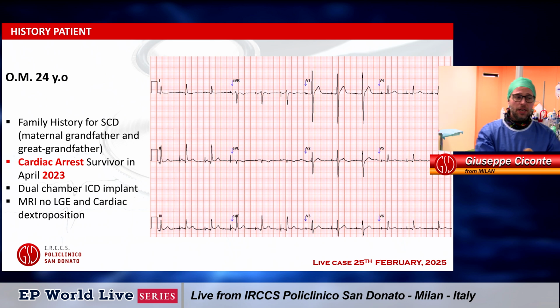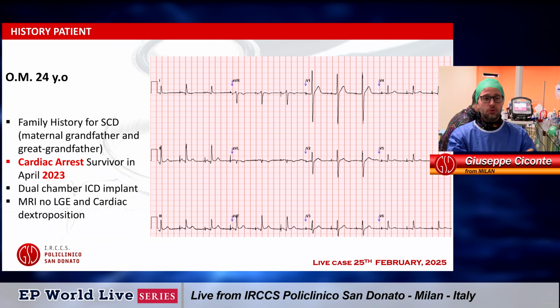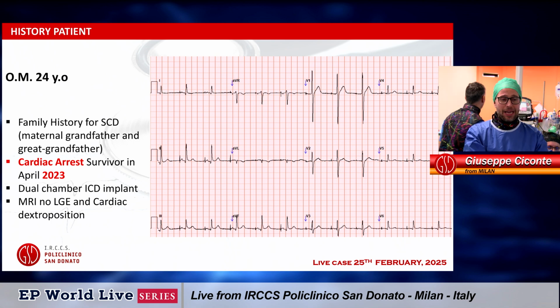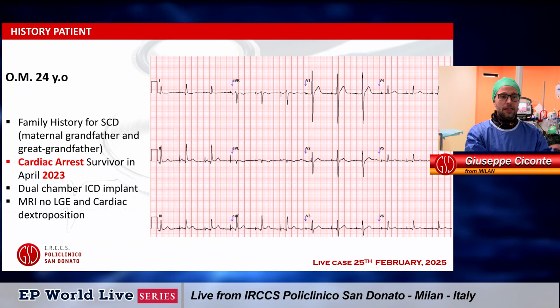Of interest here, we can see the ECG. Although you might see, due to his bradycardia, the pacing in the right atrium, you can clearly appreciate in the inferior leads an early repolarization pattern. Here you see a pseudo delta wave in the terminal part of the QRS, indicating a late depolarization pattern, which is not the malignant form Professor Pappone has shown.